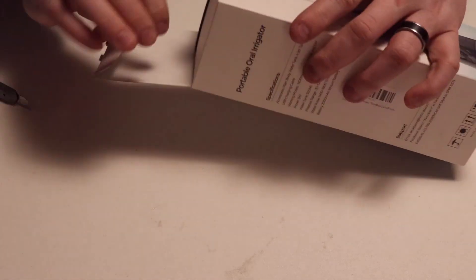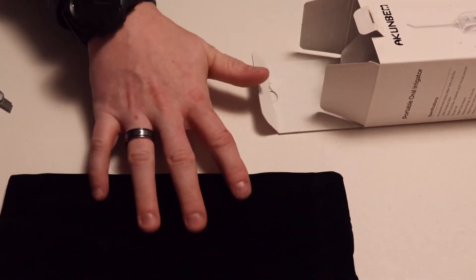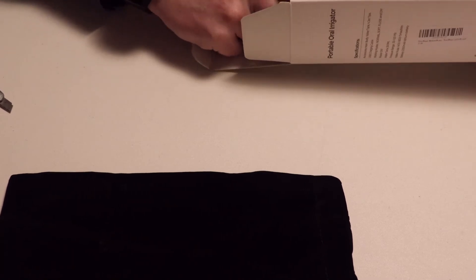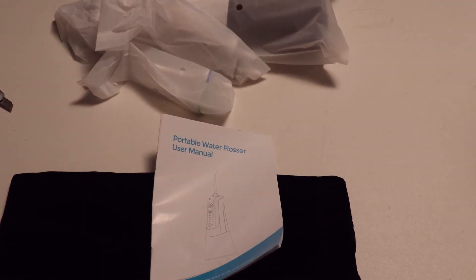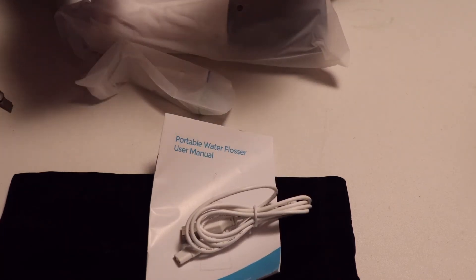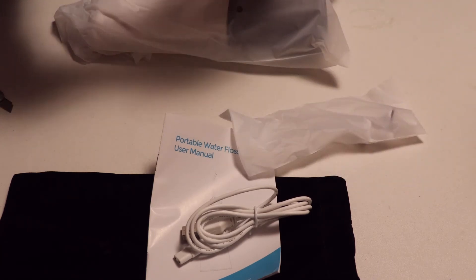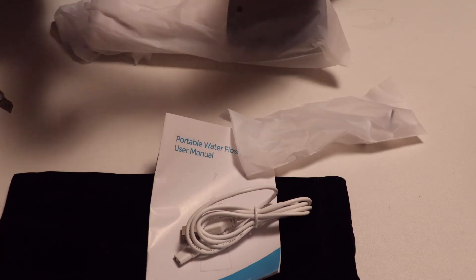Let's get this open and see what we have inside the box. First, it looks like it comes with a nice bag to store it in. You have your basic instruction sheet, a USB to what looks like a proprietary plug-in to charge it. There's two squirters and two more — it looks like they're color-coded so you know whose is whose.